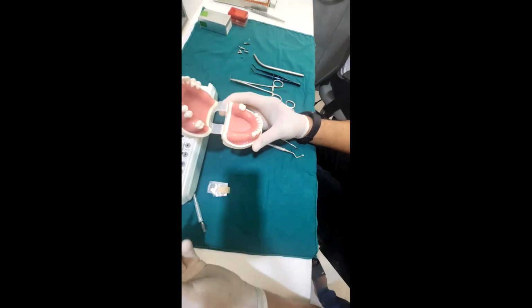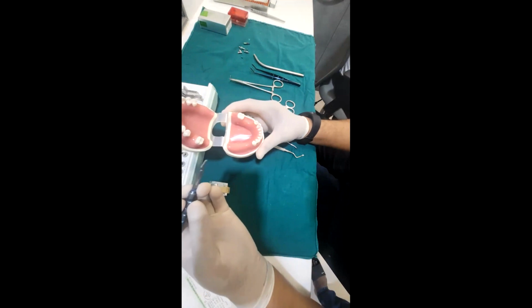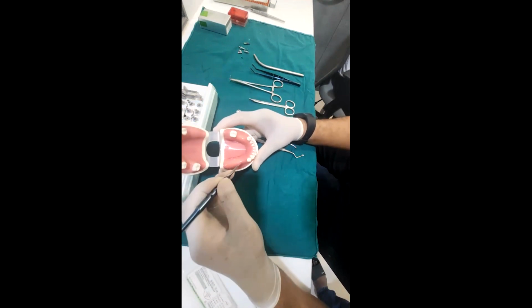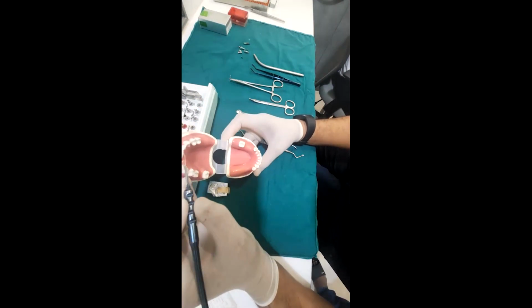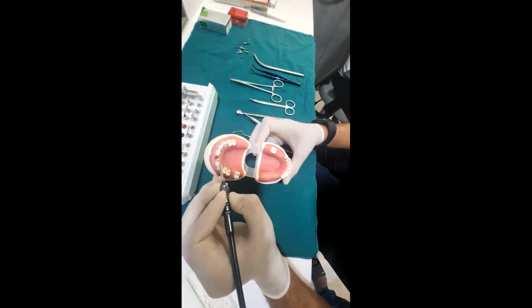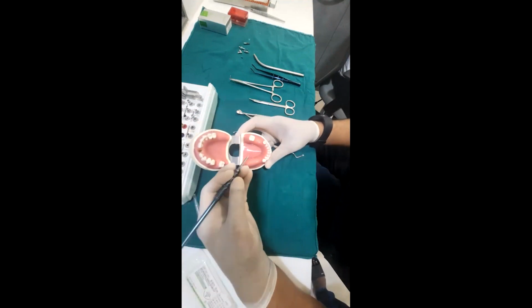So now we come to the surgical phase. It's hands-on. What we need to do is raise a nice flap. As just mentioned, we would like to not go to the center of the crest, but a little more lingual. If you are doing upper, then more palatal. If you are in the anterior, then again a little more palatal over here, so that you can have more soft tissue bundle for a good emergence profile.